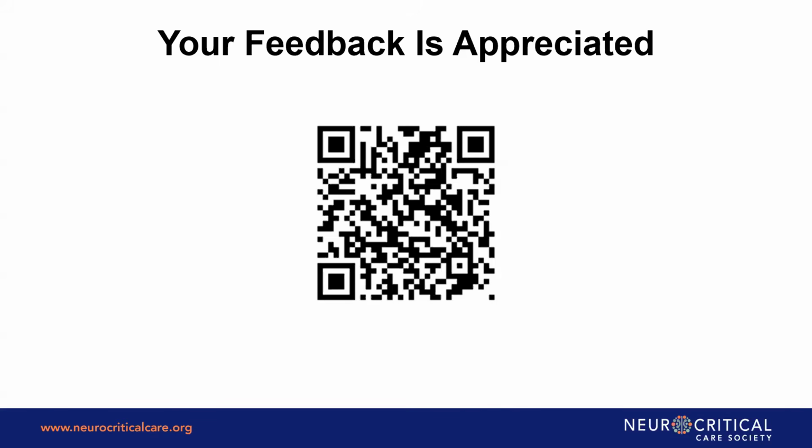So spot checking with a Ceribell or a very limited montage is great for burst suppression pattern, because it's such a radical finding, you don't need the finesse of a full montage to detect burst suppression pattern, especially for ICP control as the student was mentioning. But I welcome your feedback.